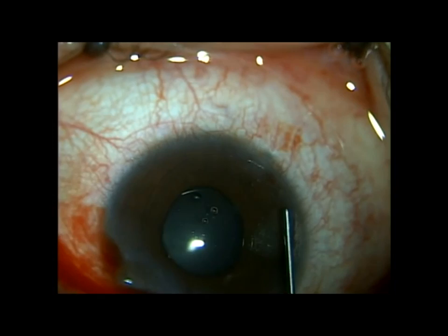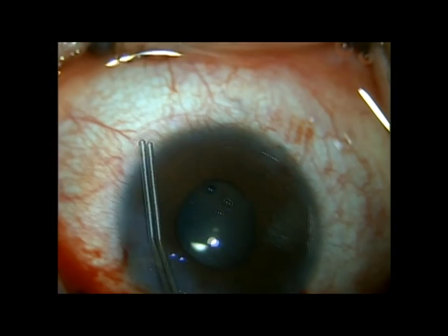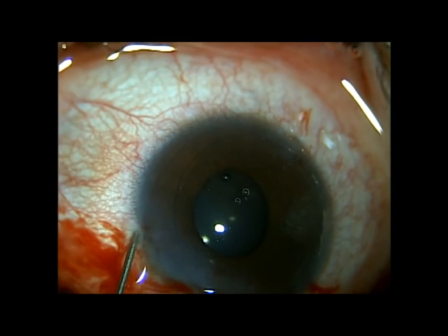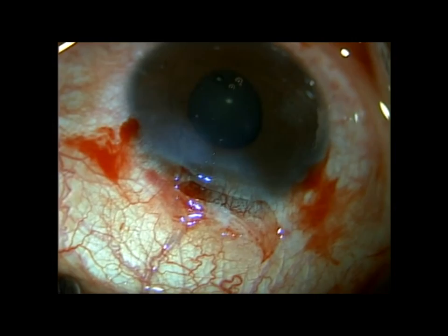The pupil has come down nicely and the lens is in good position. We're making sure the IOP is physiologic. We'll come back in two days to do his other eye, and then about three weeks later we'll lift this flap and do a myopic astigmatism treatment with the VISX laser. I'm careful to leave him a little myopic with astigmatism because if I left him with mixed or hyperopic astigmatism, the excimer ablation results would not be as accurate. Double-checking to make sure everything is watertight. Thank you for your time and attention.